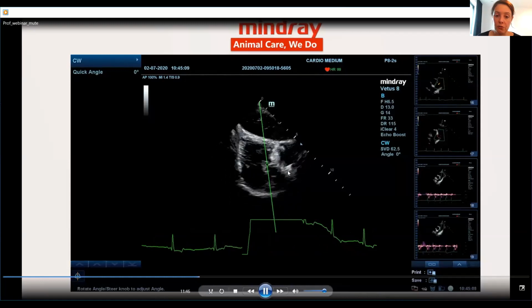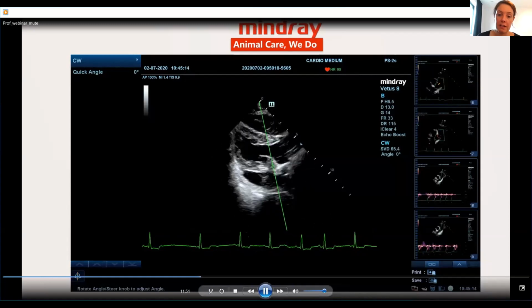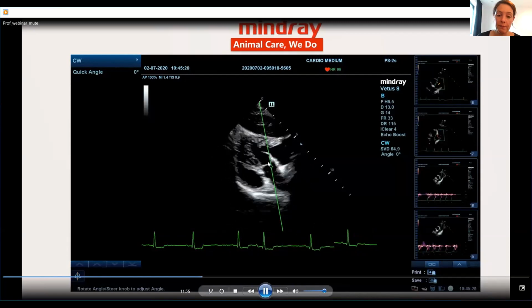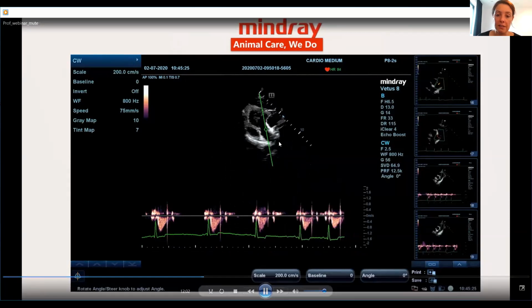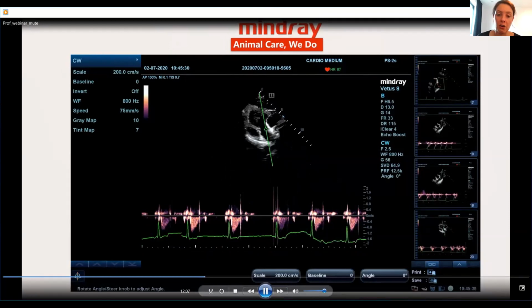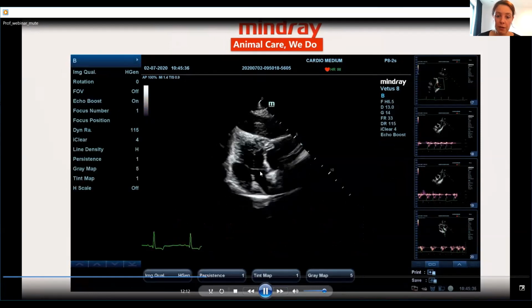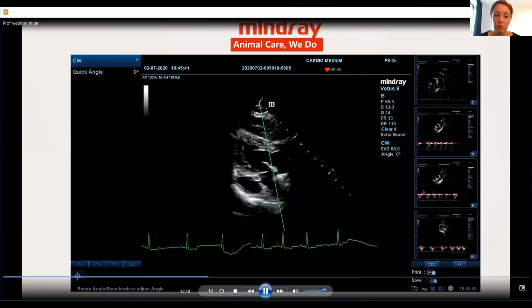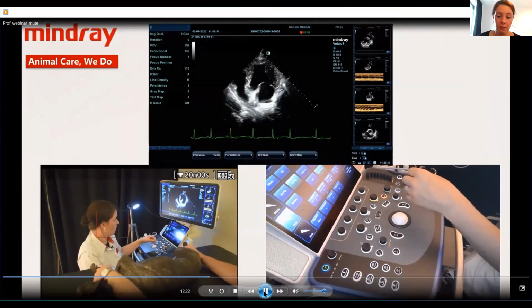What you try to do is angle your continuous wave Doppler as parallel as possible to the aorta. And here you see this different shape. This is not an actual sample gate. This is the continuous wave Doppler, and the continuous wave Doppler is actually measuring the velocity across all of the line. It's a continuous wave Doppler measurement because, of course, we try to measure high velocities and we are very deep, so it's easier to use the continuous wave. Okay, so that was an illustration of the subxiphoid measurement.